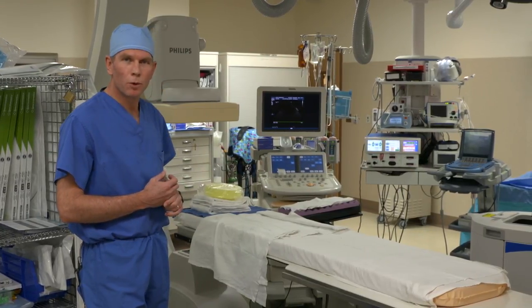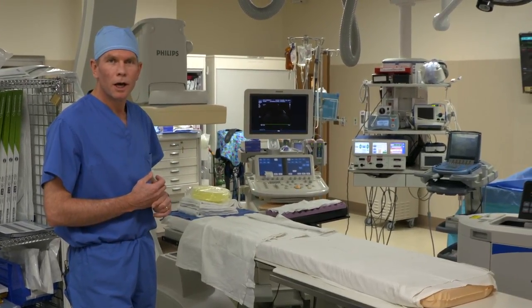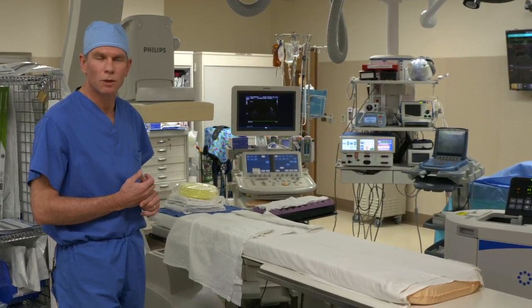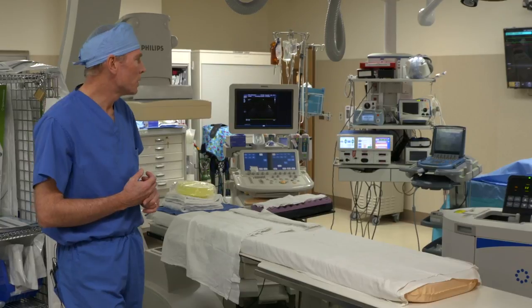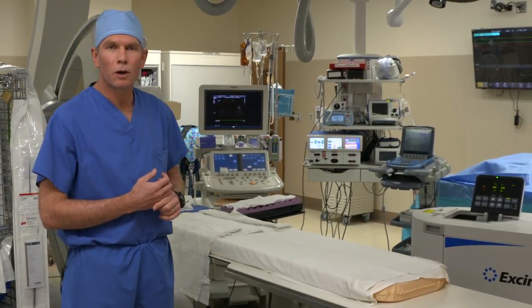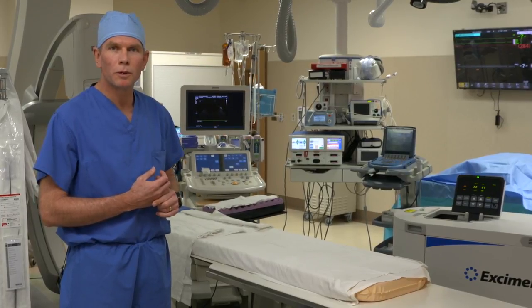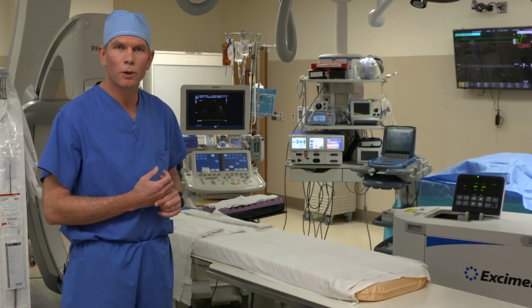Transesophageal echocardiography is employed on all cases and helps with identification of vascular or cardiac injuries, should that occur during the procedure. We have available all open cardiac surgery instruments and equipment to perform an open repair of an injury or an open extraction.